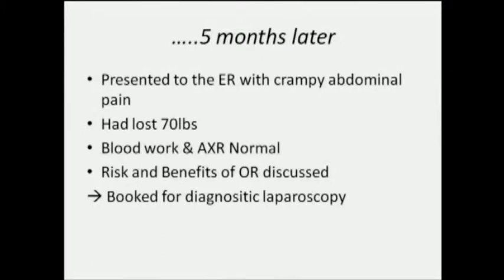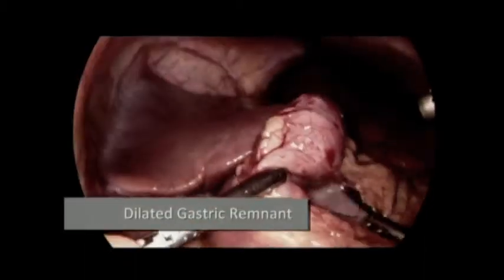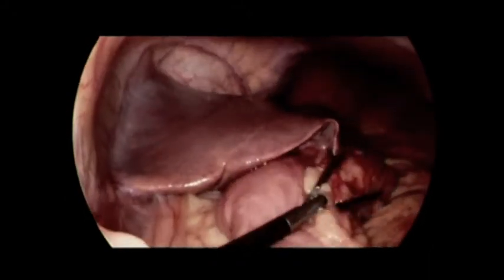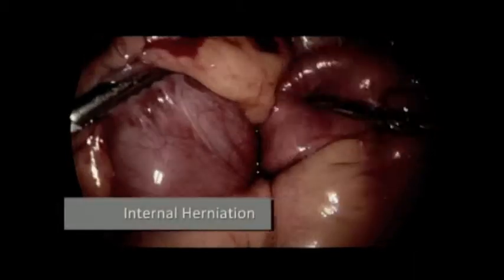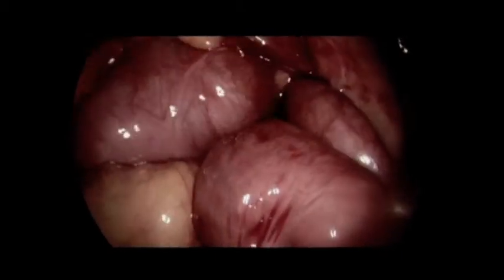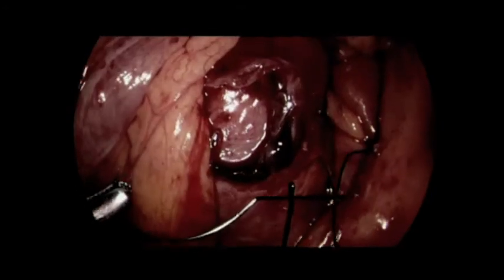Five months following the bypass, our patient presented to the emergency department with crampy abdominal pain. She had lost approximately 70 pounds. We were highly suspicious of an internal hernia and she was therefore taken to the OR. We were quickly able to identify a dilated gastric remnant, which confirmed our suspicion of obstruction. We then identified an internal hernia through Peterson's space.